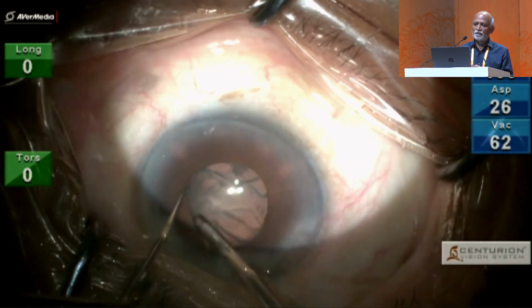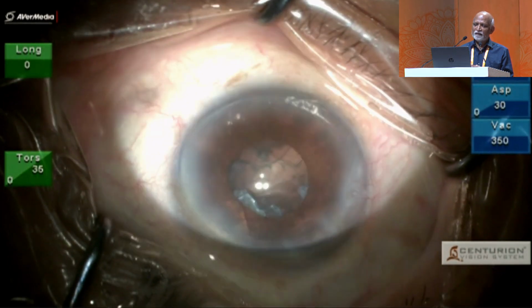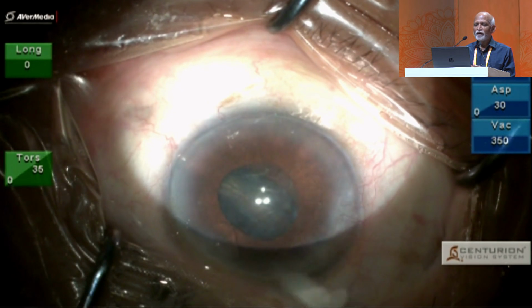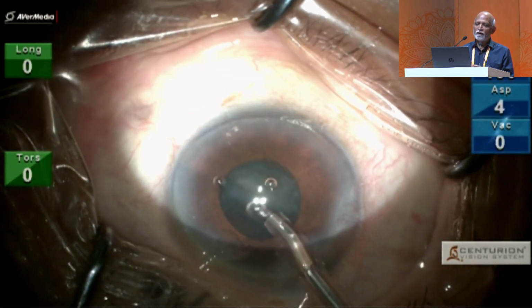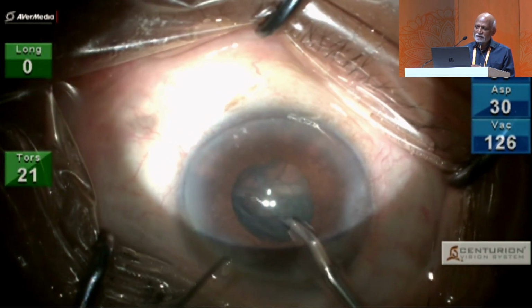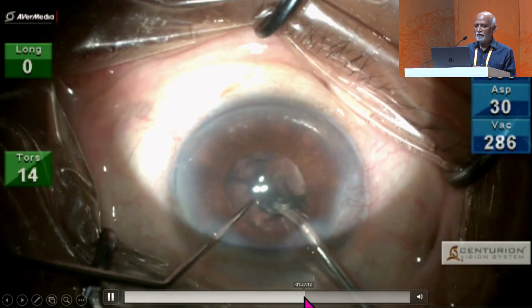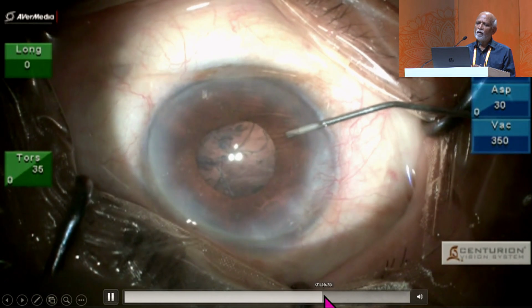I just came out and I realized that when I come out, the chamber shallows and the epinuclear plate just comes out. It is so simple and easy, and you can utilize this when you get into trouble with an epinucleus which is just not coming out. But best is to enlarge the pupil whenever it is possible. There you will see me enlarging the pupil, and that solves all the problems.